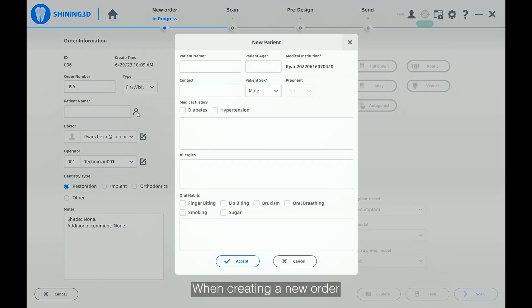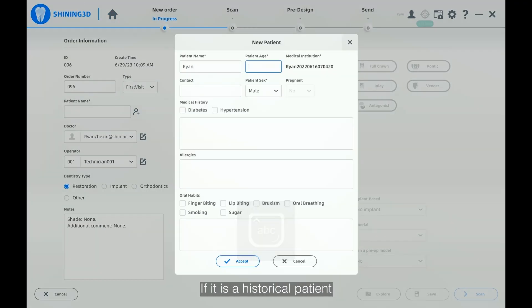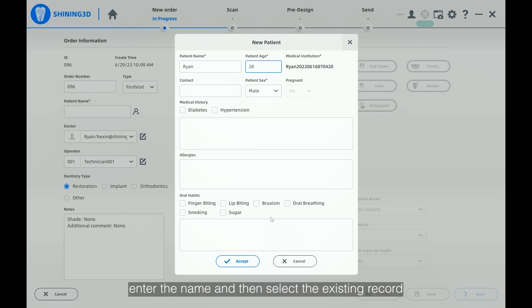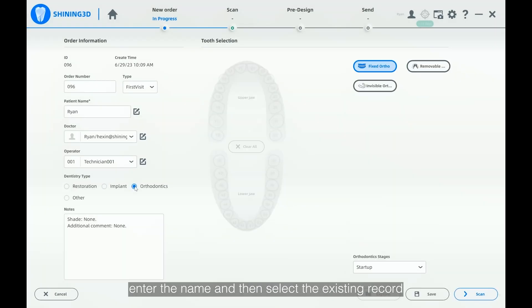When creating a new order, we need to create a new patient. If it is a historical patient, enter the name and then select the existing record.